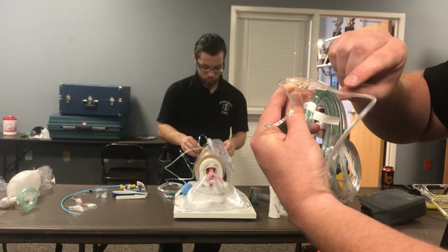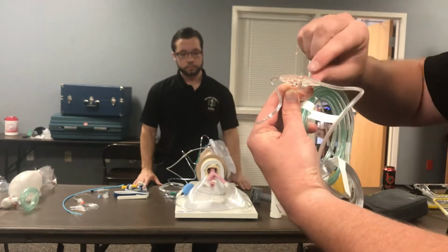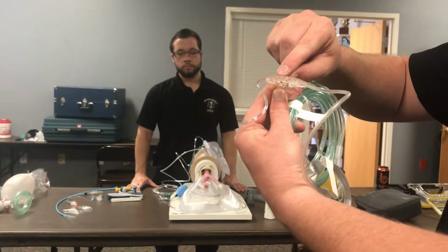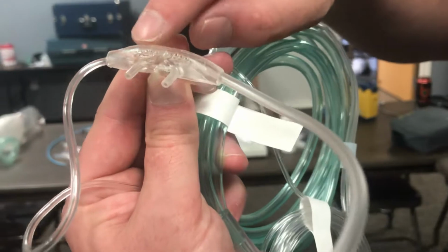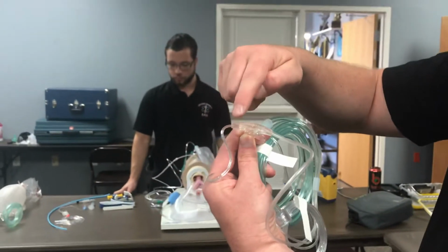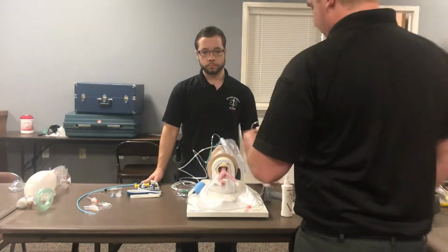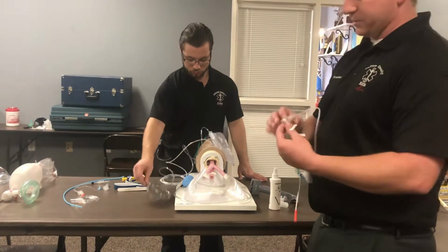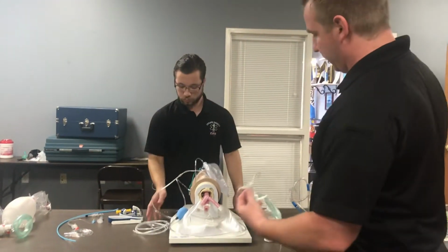If you look real close, the travel of the O2 tubing goes right here, and all it does is essentially spray oxygen out a bunch of these little teeny holes up towards the nostrils, whereas on a nasal cannula, these things would actually be where the oxygen's coming out of. So in this case, we definitely want to be using a nasal cannula because it's directing O2 directly out of the nasal prongs into the nasopharynx.